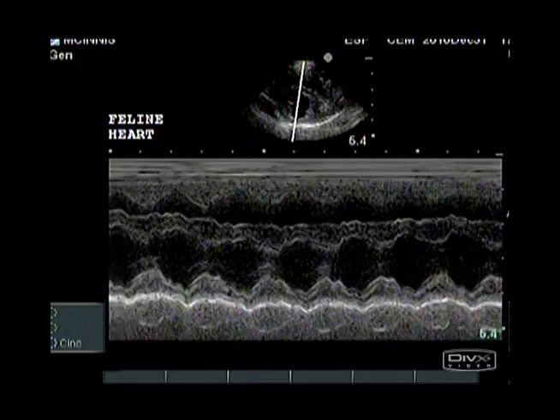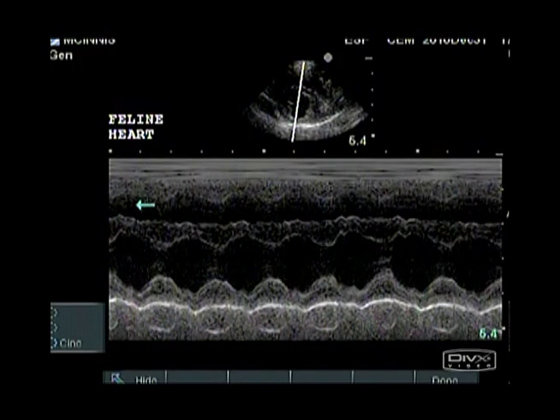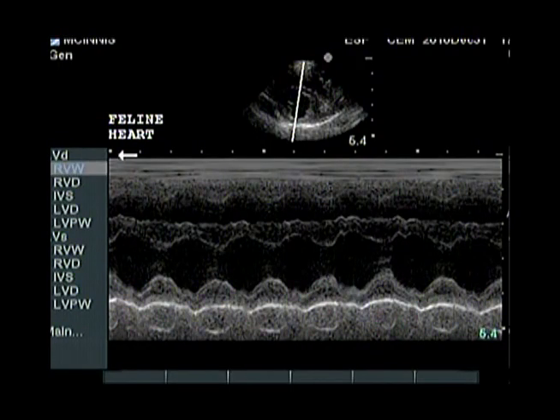With a frozen M-mode image, use Cinematic Loop to choose the best image of diastole and systole. Activate the calculations package of your ultrasound machine. Use your trackball or touchpad to select the left ventricular or Teichholz measurements. In most machines, this allows you to make standard measurements of the left and sometimes right ventricle. With these measurements, your machine will also make standard calculations of cardiac function.